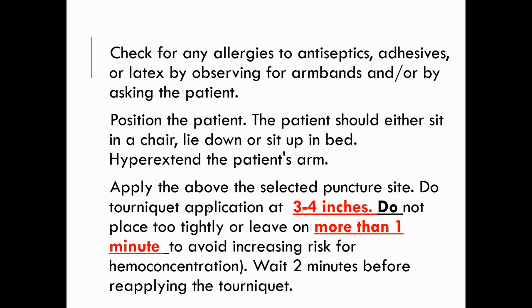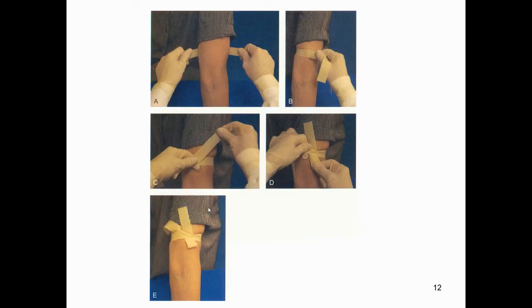So, kung mo na siya, first yung mga buhaton kay mag-apply ka og tourniquet para i-check nimo kung asa ka nga site magkuha. And after that, you will remove it, then mag-sterilize na kasi area, mag-clean ka, and all. Then after na, kay pa doon na ka mukha balik, that's the time you reapply your tourniquet. This is the proper way of applying the tourniquet. So, mag-send na ako video para po na mo'y idea on how to do this.